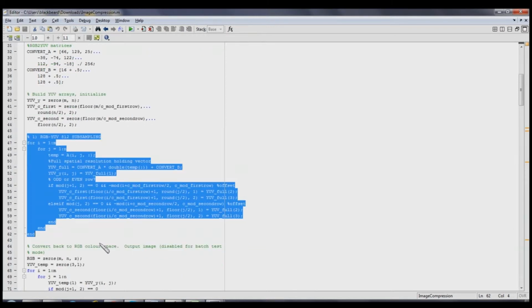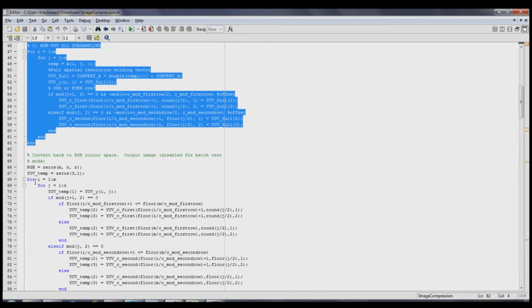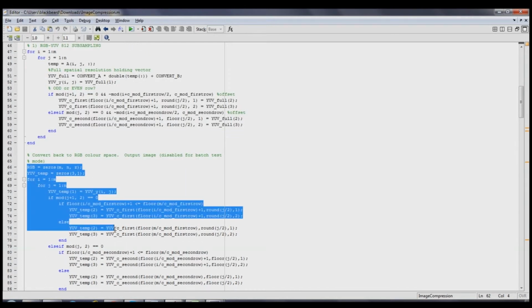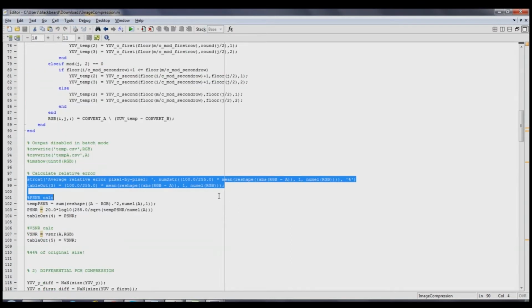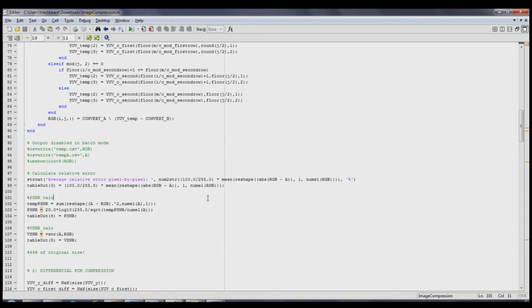And then, since YUV subsampling is the only lossy portion, we converted back using the inverse of the previous portion just to get benchmark values. So next we do pixel by pixel error count, peak signal to noise ratio, and a custom created visual signal to noise ratio. And those are kind of our point estimators.